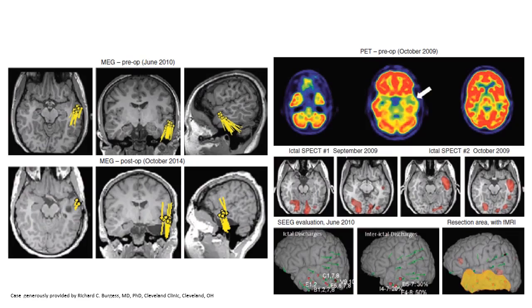His first video EEG evaluation at age 9 captured unclear events that appeared to implicate the right frontal region, and a second video EEG evaluation recorded 10 seizures from the right central region. At age 10, another video EEG was performed and found left temporal sharp waves, while seizures were recorded from both the left temporal and the right parietal central regions, prompting a MEG study.